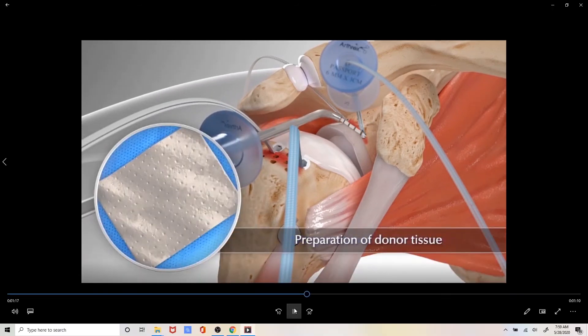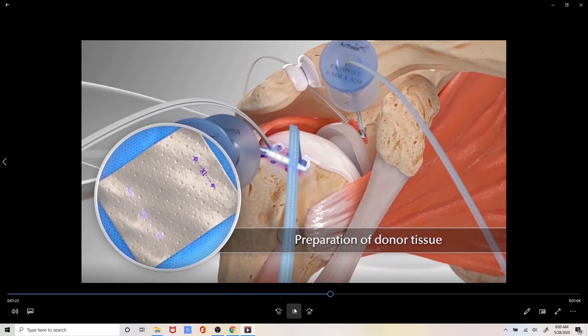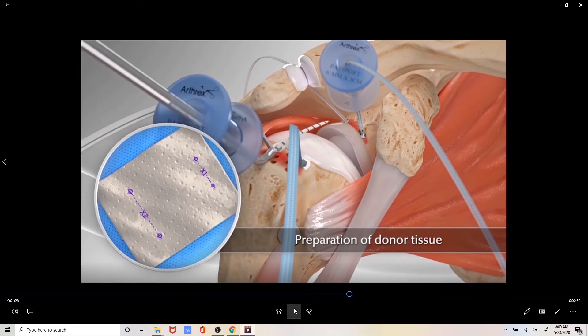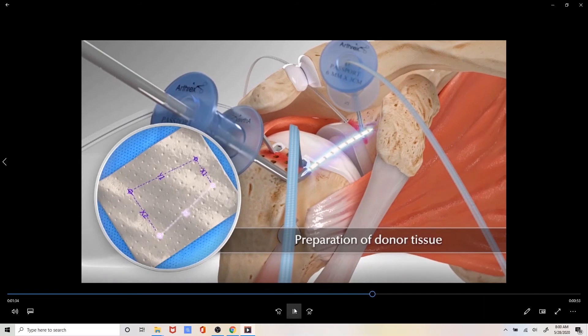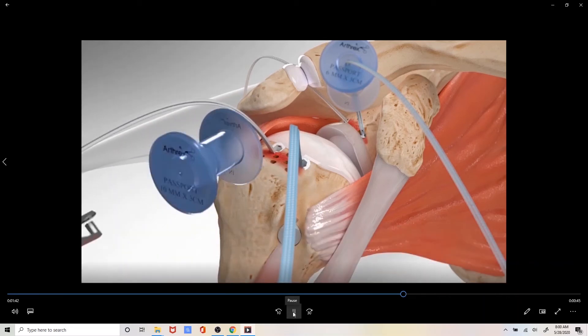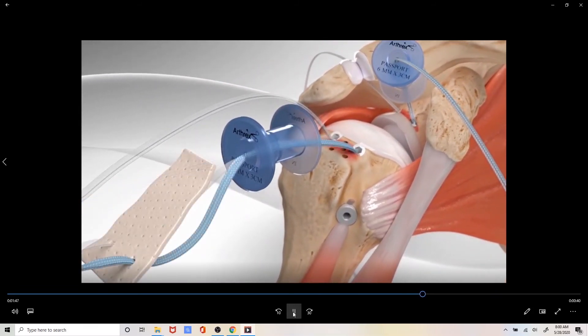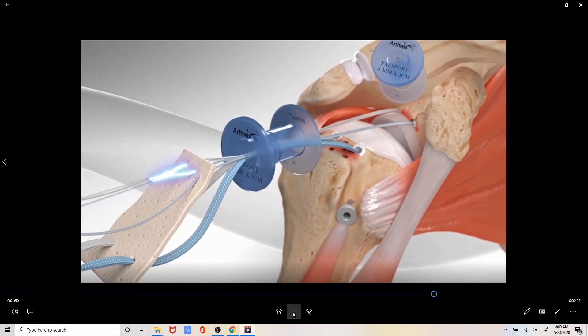We will now measure the distance between the anchors and mark them on the appropriate position on the SCR graft. This allows us to place the sutures on the outside of the body and then transfer the graft into the joint. We then take an additional five millimeters around the course of the graft and shape the graft to the patient's shoulder. We then retrieve the sutures out of the body and pass the stitches up through the graft on the outside of the body.